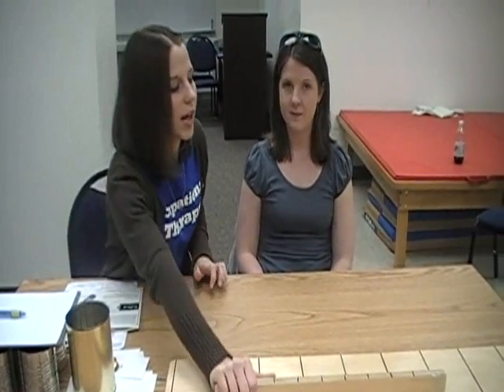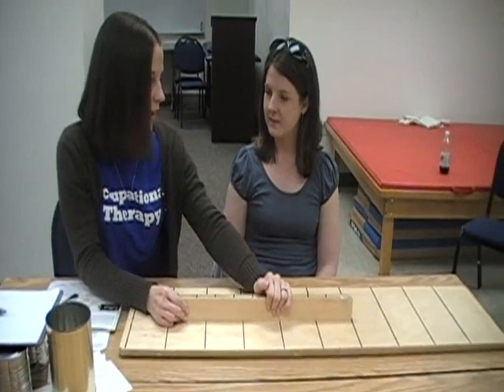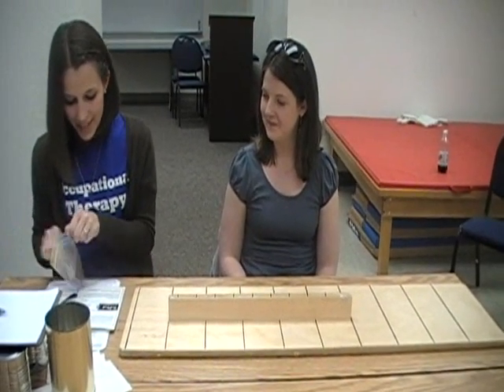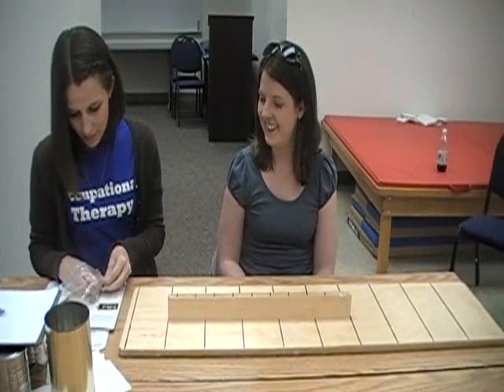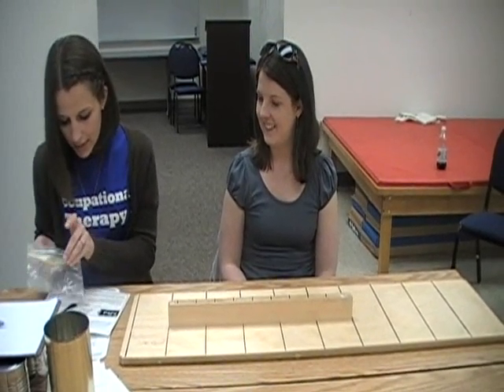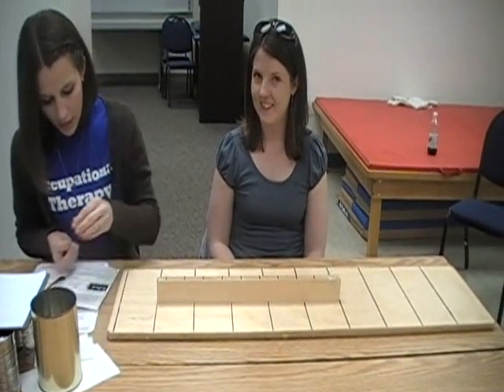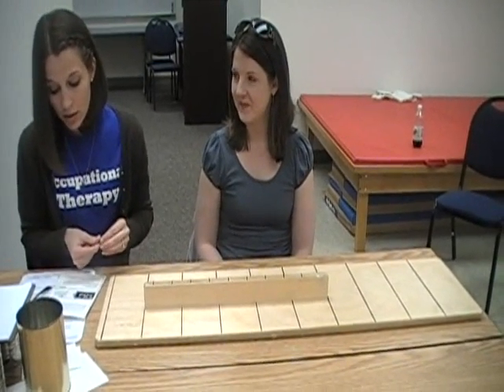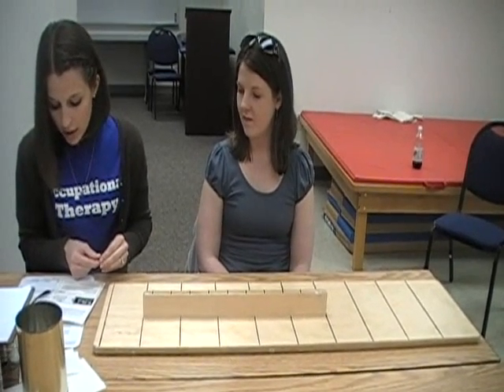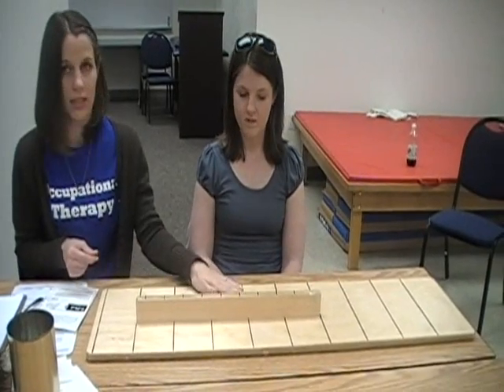The next task is called simulated seating. You will get your board again and place it approximately 5 inches from the front edge of the table. Then you will place 5 kidney beans on the board, oriented to the non-dominant side of center, parallel to and touching the upright of the board, 2 inches apart — which will be this part.